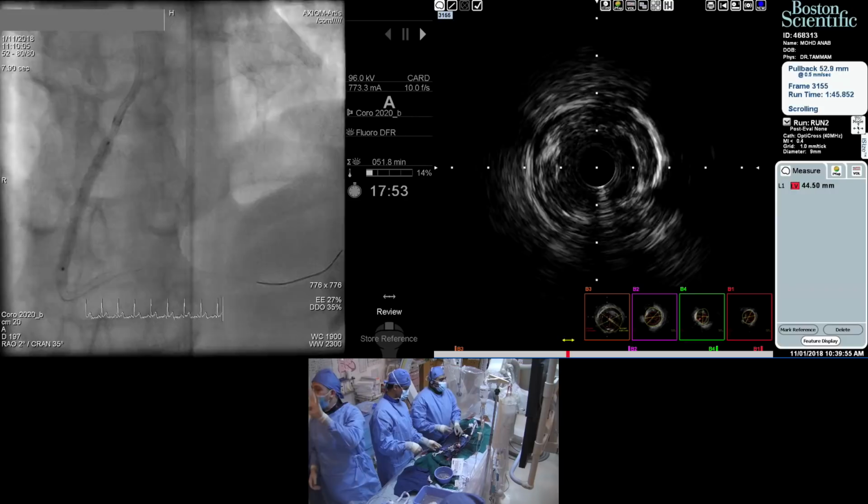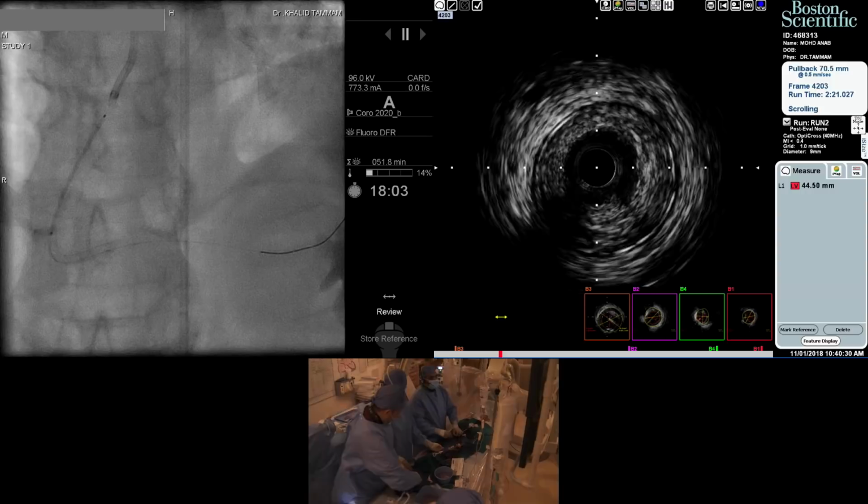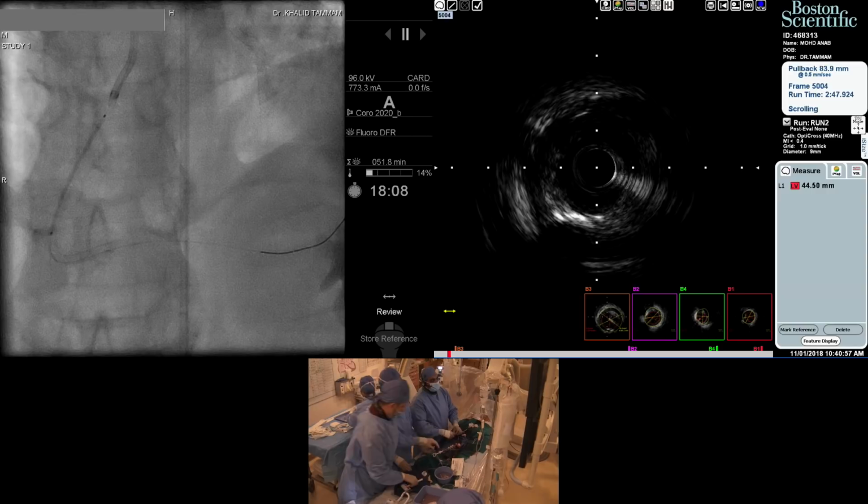Okay. You see the very proximal right, which is a huge vessel of 4.5, and all this has been stented. But all the way up to the guiding, where we are arriving here, you see that there was a lot of plaque burden. And this is the guiding, and you see the guiding sits in the plaque.